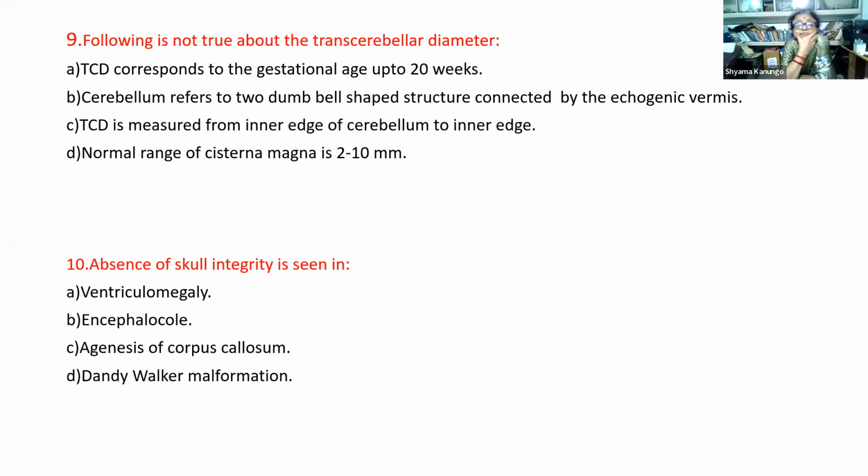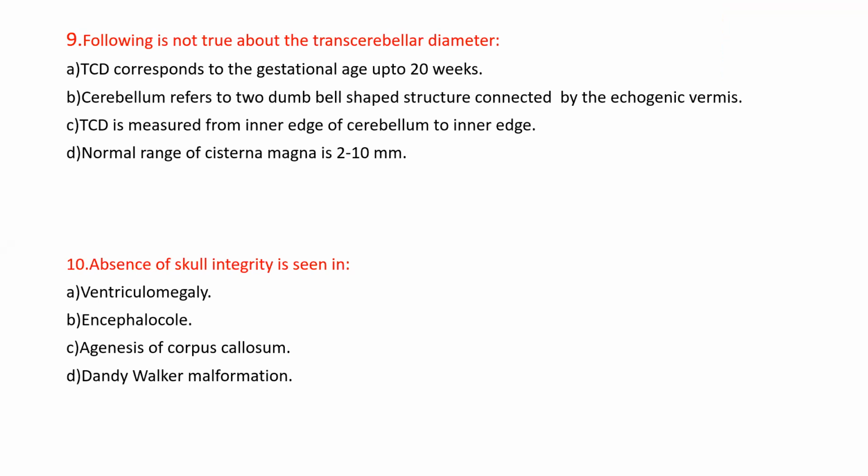Question 10. Absence of skull integrity is seen in ventriculomegaly, encephalocele, agenesis of corpus callosum, or Dandy-Walker malformation. Encephalocele. Correct.